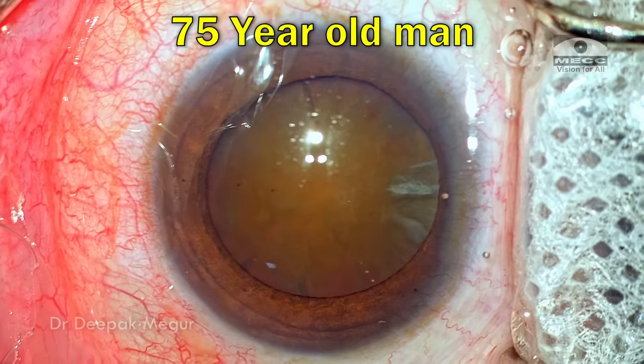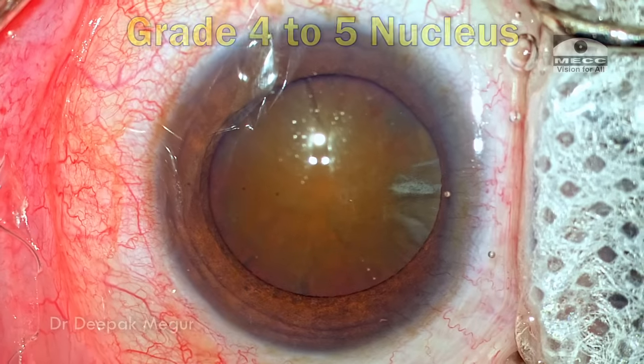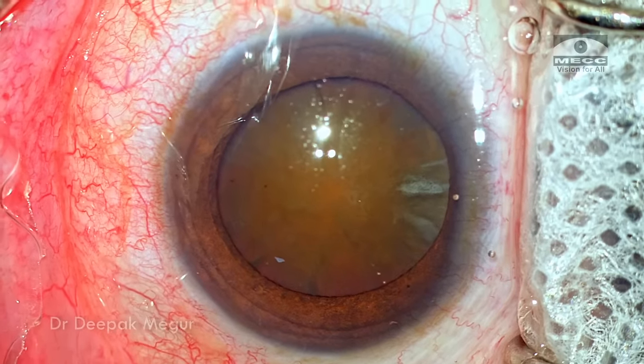Hello friends. This is a 75-year-old gentleman who has this brown cataract which is about grade 4 to grade 5 nucleus sclerosis. He is undergoing phacoemulsification. The patient is quite cooperative so we're going to do it under topical anesthesia.